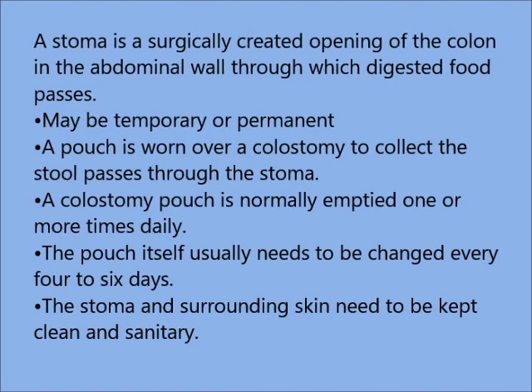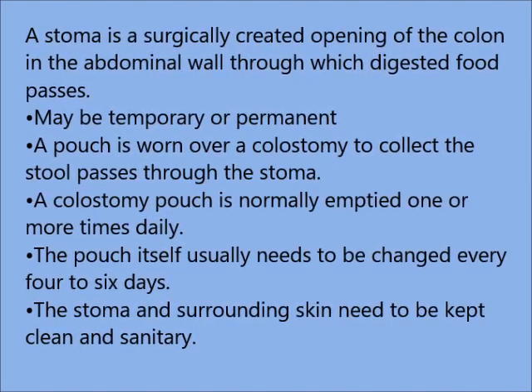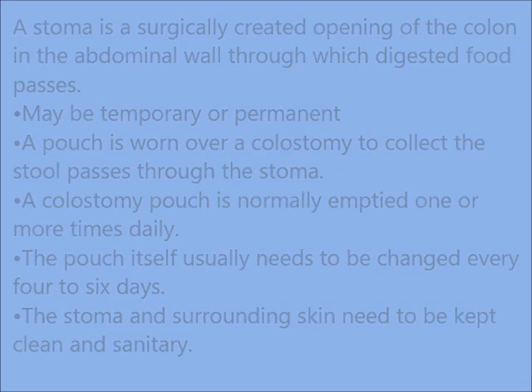A colostomy pouch is normally emptied 1 or more times daily, and the pouch itself usually needs to be changed every 4 to 6 days. And the stoma and surrounding skin need to be kept clean, dry, and sanitary all the time.